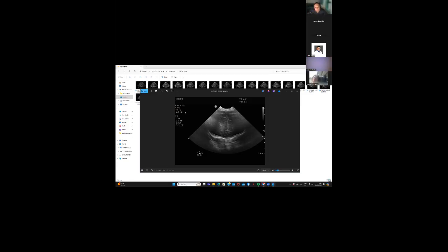Sorry to say, it's a pediatric head, not abdomen. I forgot to edit that. Your images are fine.